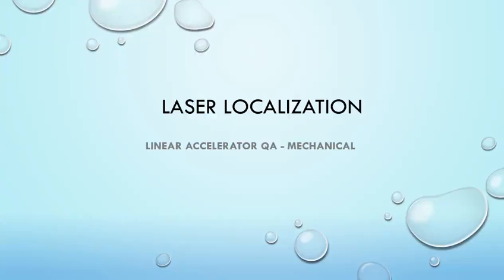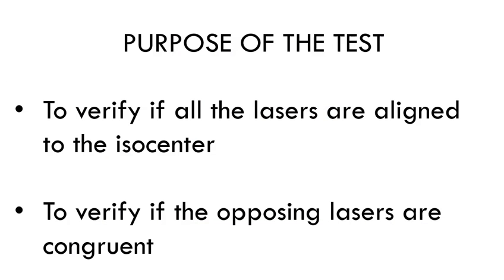Let's go through laser localization. This is the mechanical part of linear accelerator QA. The purpose of this test is to verify that all the lasers are aligned to the ISO center and also to verify if the opposing lasers are congruent to each other.